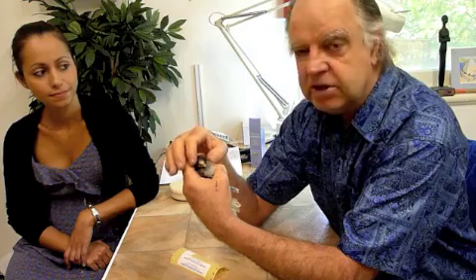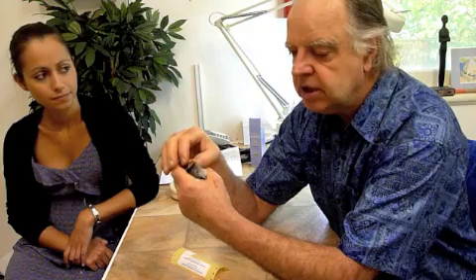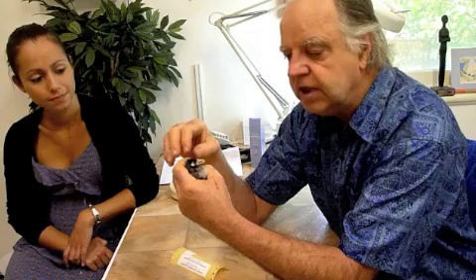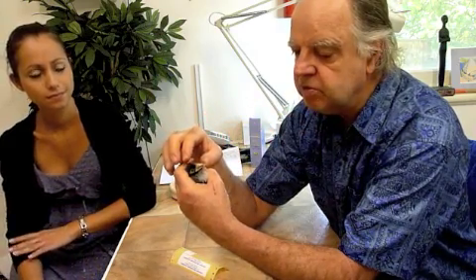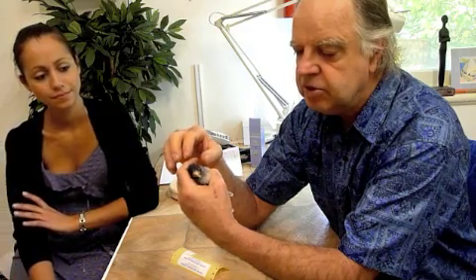Then we tried putting an acupuncture needle lengthwise through here, down the jaw. But it took multiple attempts and it was not possible for me to keep the pin within the bone the whole length of the jaw — it would tend to come out one side or the other.